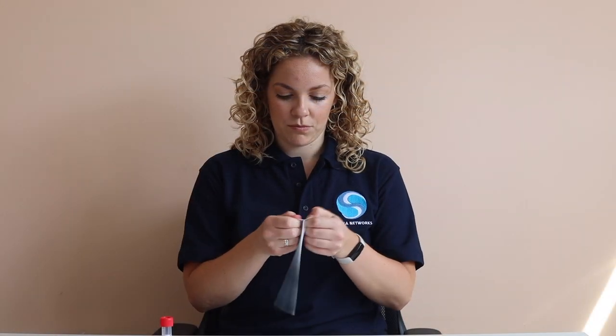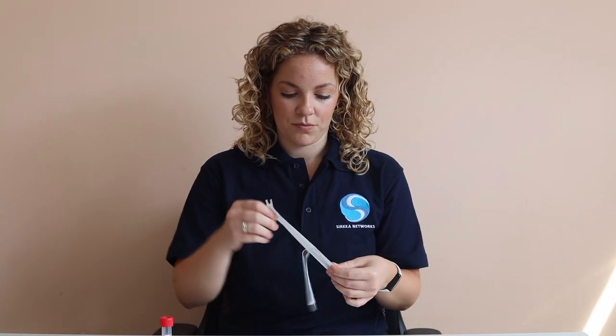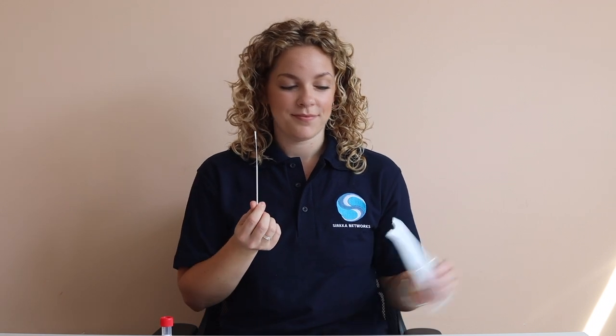Next, open the packet containing the sterile swab, stick end first. It is important that you do not touch the fabric end of the swab.